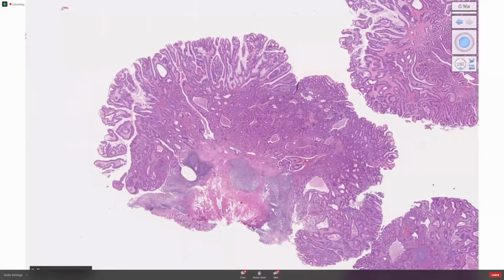So what is your choice, Professor Sano, for this case? If possible, I would additionally perform EUS and confirm submucosal layer invasion. But anyway, the surface pattern is still preserved as type 4, so I would perform ESD or underwater EMR. I agree with this strategy.